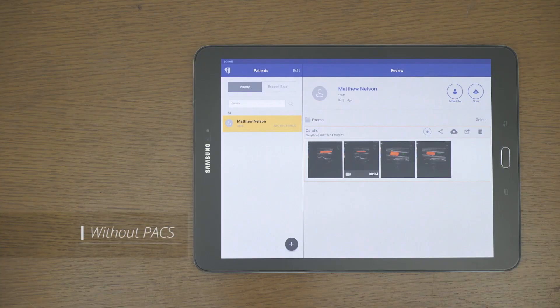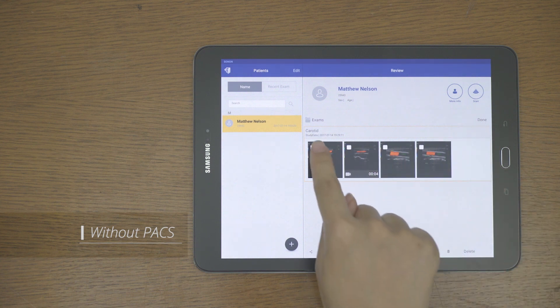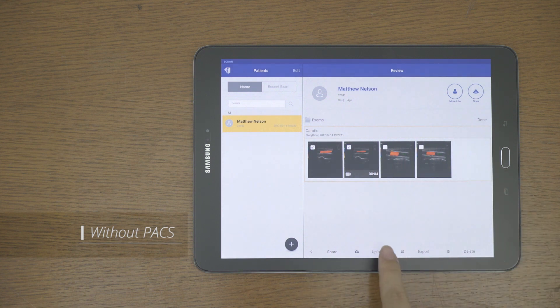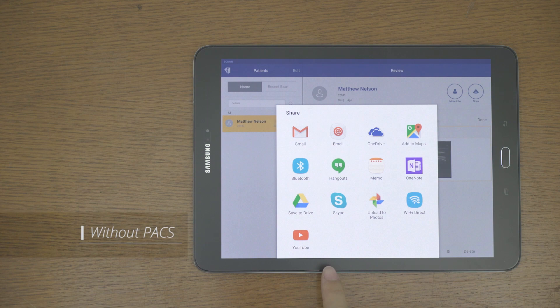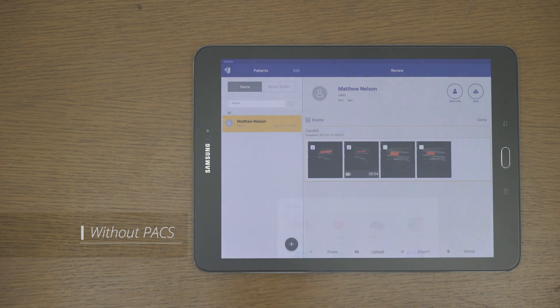If you do not have PACS, you can transfer using the share feature. Select the image you want, tap the share button to see a variety of apps that share images within your mobile device.